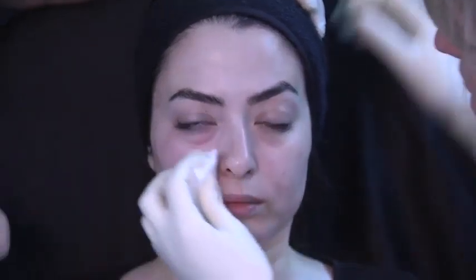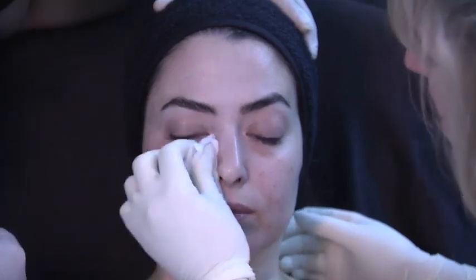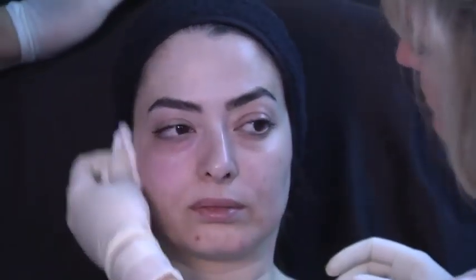Do you release the ligament before you inject? Yes, I have to go through the ligament to get into this area, but I am under the muscle, okay? I sometimes have to go through the ligament. I only do this with Vital Light, okay? Because it's a nice product to do that. And you can see that later, can you look at the camera and go like this, okay? We can see that she still needs a little bit here, but we have corrected the palpebromalar groove better, okay?